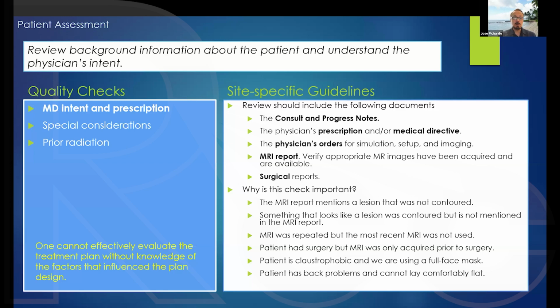You should also look at the physician's prescription or medical directive, where the physician indicates what fraction size and number of fractions he or she is planning on using, what type of treatment modality, and so on. You should also look at the physician's orders for simulation, setup, and imaging so that you know what type of setup was used and maybe some specifics the physician wants to focus on, like an organ at risk that needs to be avoided.